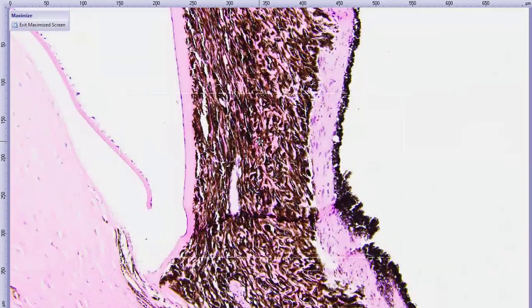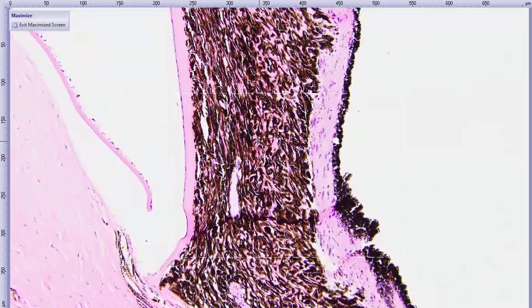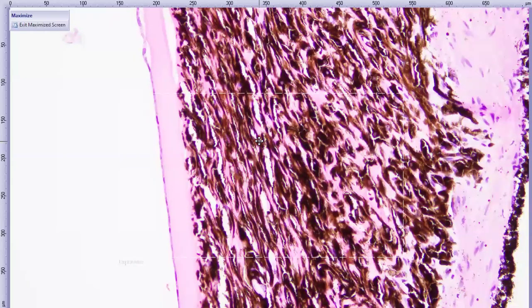So this is what we would call descemetization of the anterior iris surface, when Descemet's membrane and the corneal endothelium continue around the iridocorneal angle and carpet the anterior iris surface. This is an unusually thick layer of Descemet's membrane in this case. I don't really know what to make of it. It's thicker than the original, right? Yeah, it is. It's bizarre.